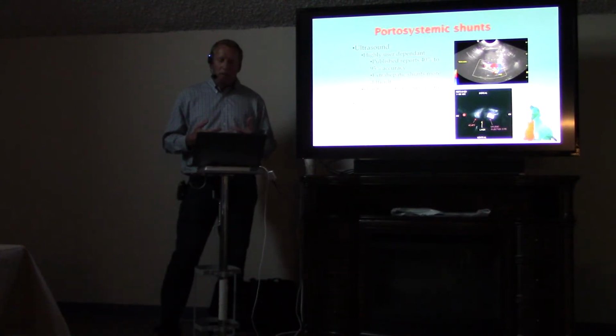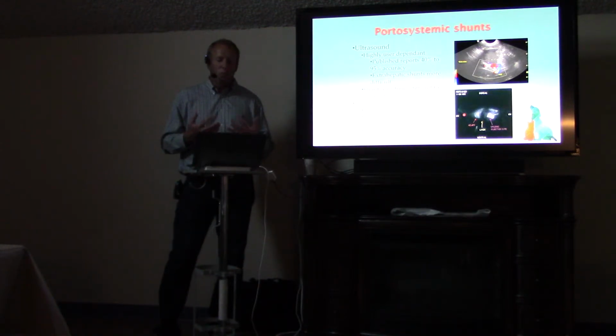But even if you can diagnose a shunt, it can be difficult with ultrasound to characterize that shunt very accurately. Usually you can determine whether it's an intrahepatic shunt versus an extrahepatic shunt, and that may be the most important type of characterization that needs to be done. But with extrahepatic shunts, knowing whether it's a portocaval shunt or a portoazygous shunt or some other type of shunt can be very difficult to determine with ultrasound.